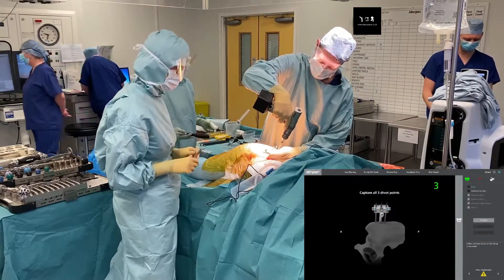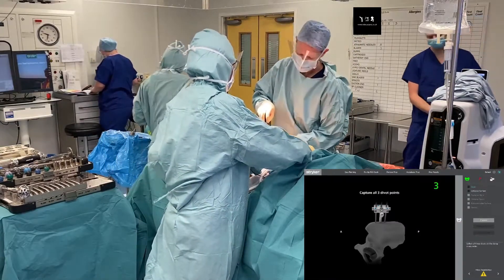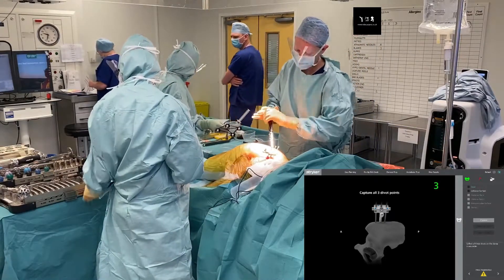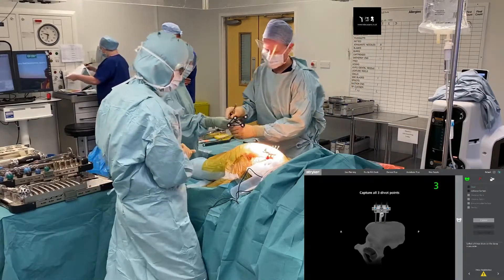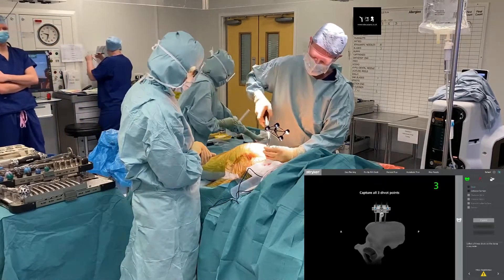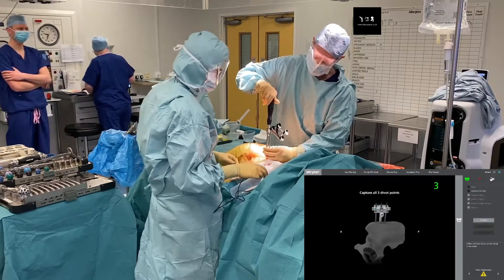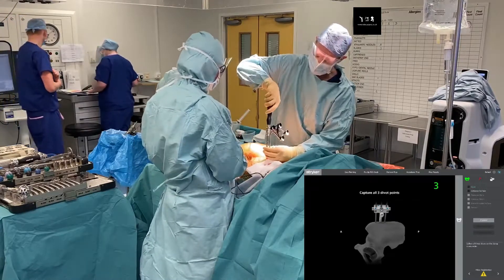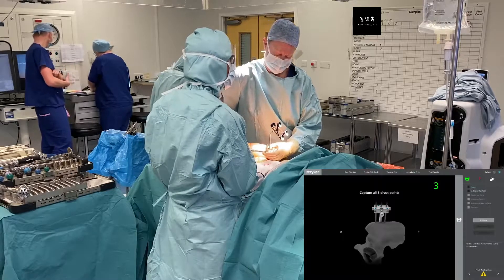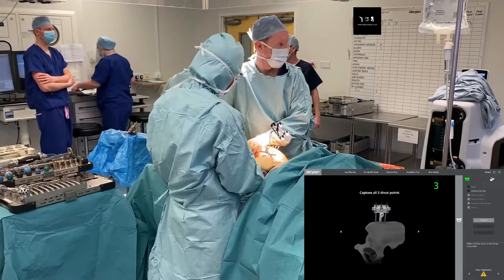I've tried to make this video as much in real time as possible so you're able to get an indication of how quick robotic surgery can be and how some of the steps for a standard hip replacement can be reduced. One of the most important things about robotic-assisted surgery and the system that we use is the pre-operative planning, which allows us to work out exactly what size implants we need for this surgery way before we've even made our first incision.